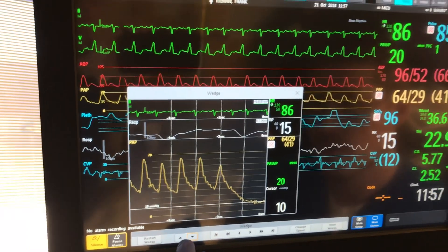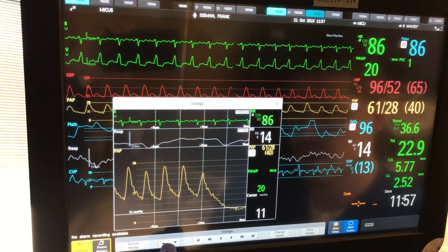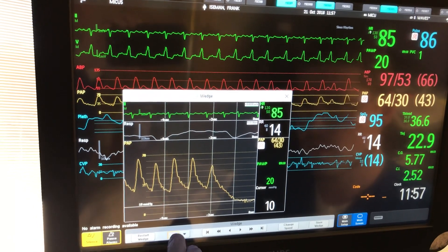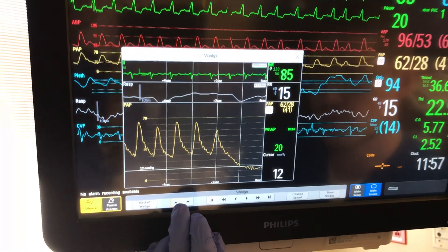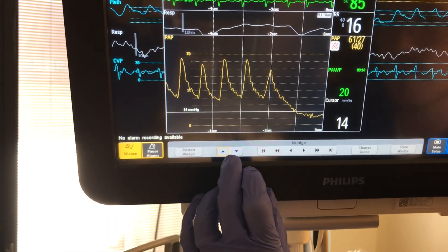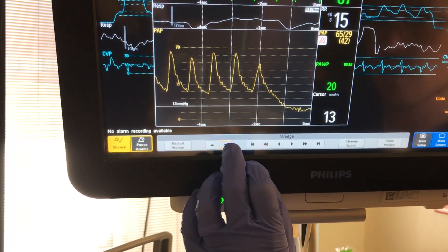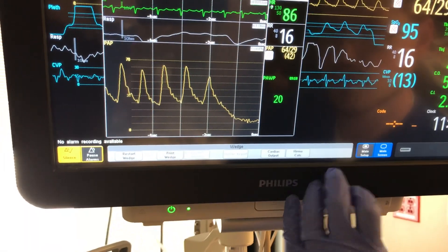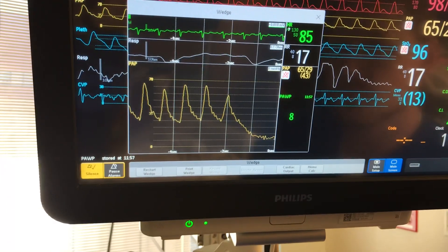Come up a little higher. I mean, that's only 11 — you're not moving that far. Come back up a little bit. I want to try and see if I can find that. Come up a little bit more. Let's go right here. I think maybe that one's here. 14? So about 14. That's more closer than when you look at my CVP.